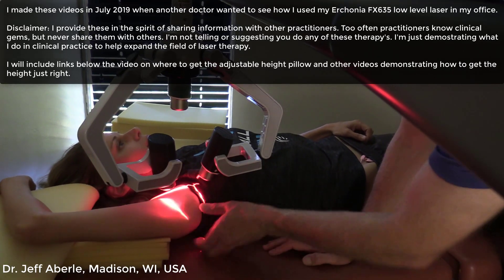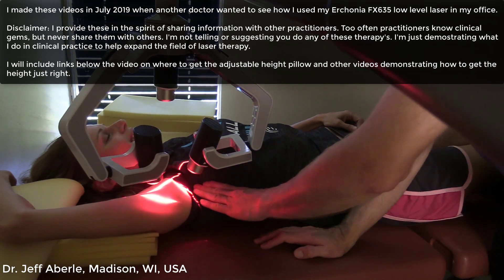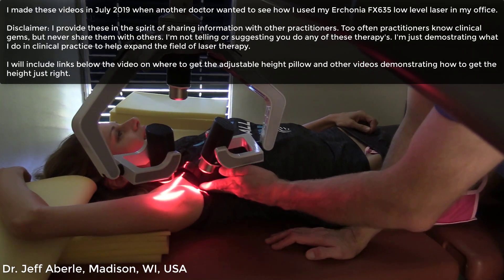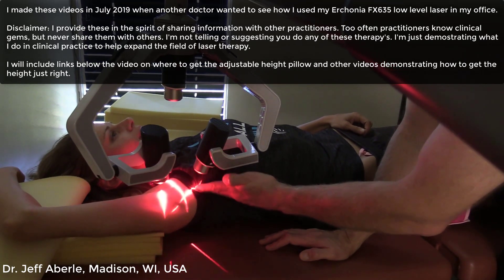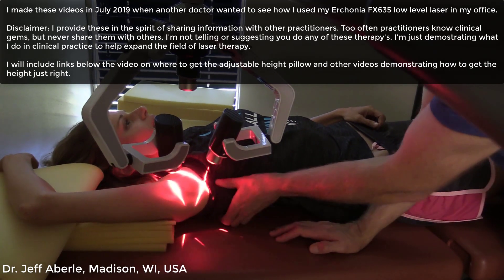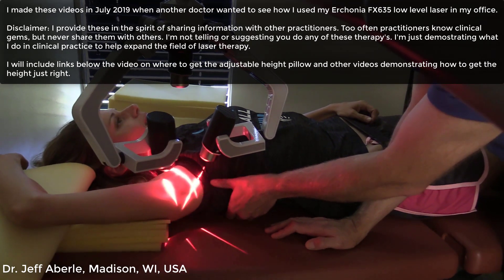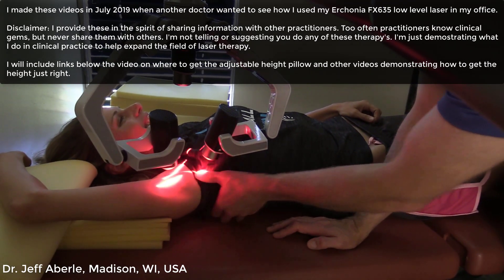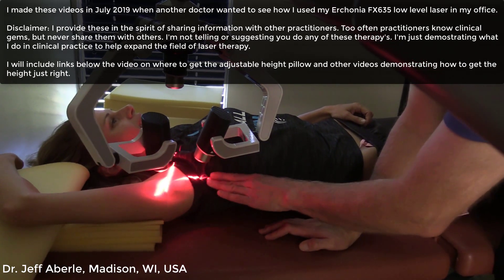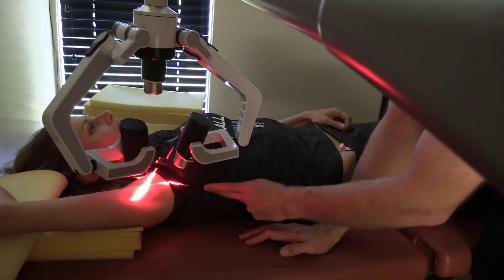When you're working in the axilla, you just got to generally feel what it's like. A couple of different things you want to do: get your hand in between and separate the serratus anterior from the subscap. That is a very common adhesion. She's got it right through here — I just cannot get my thumb any further than that. If I push harder, it'll just hurt. So right now I'm not treating that; I'm treating the tighter stuff up in here. That's something to always look for — that separation. You can try to wiggle your finger in there, but the lasers will loosen this all up.